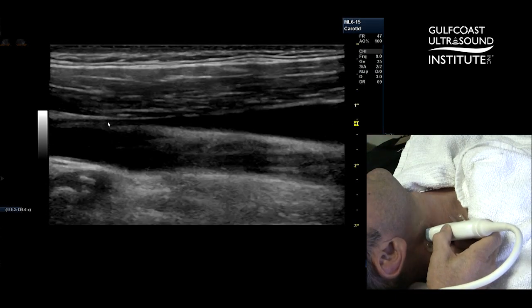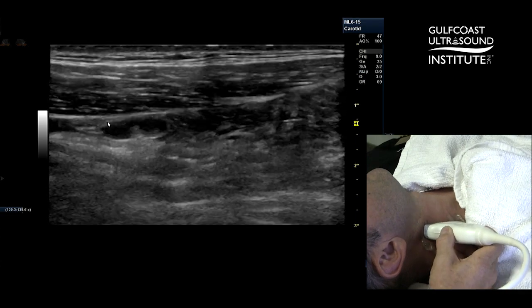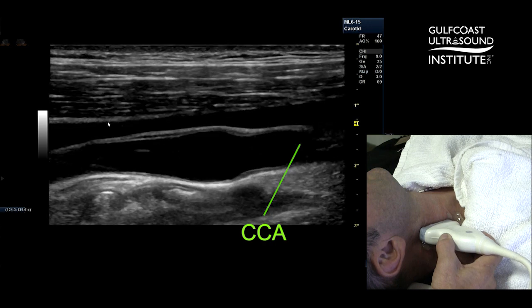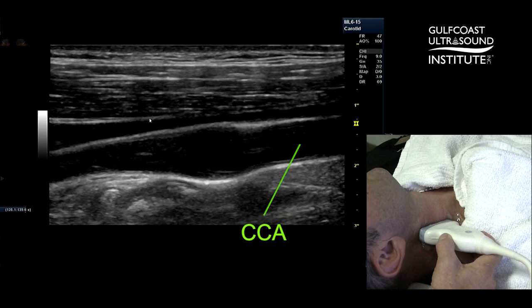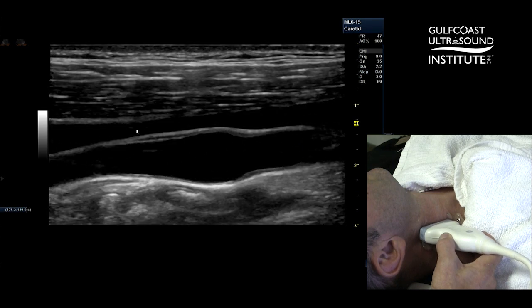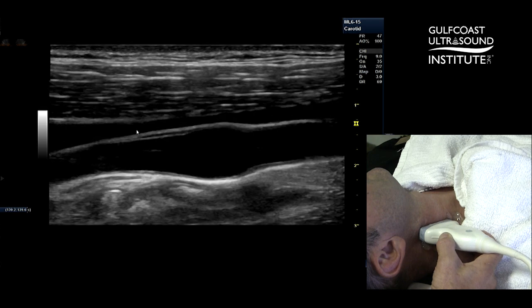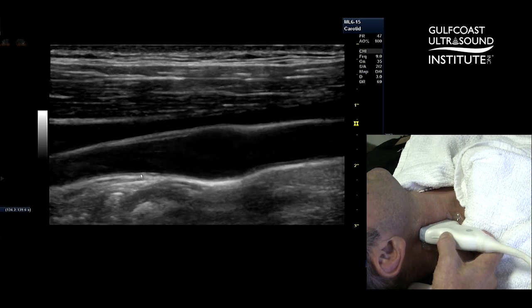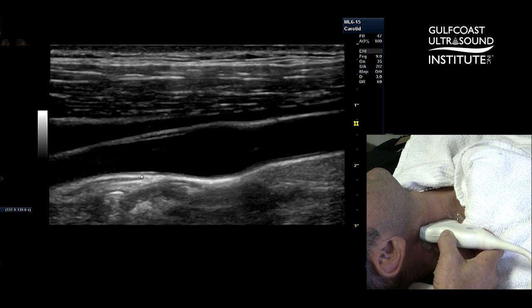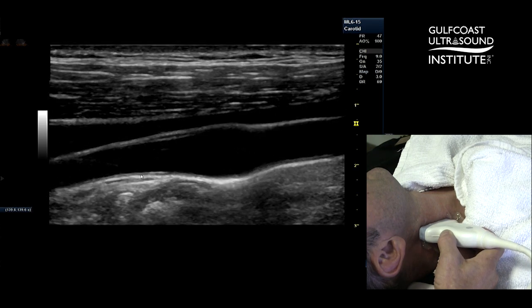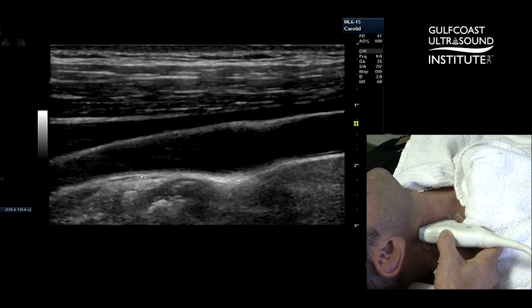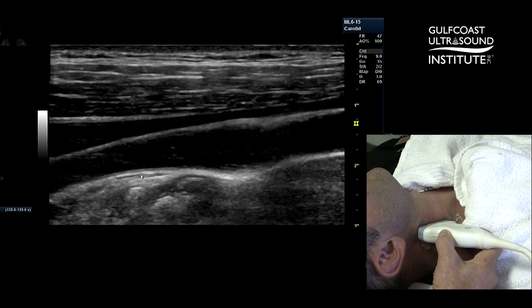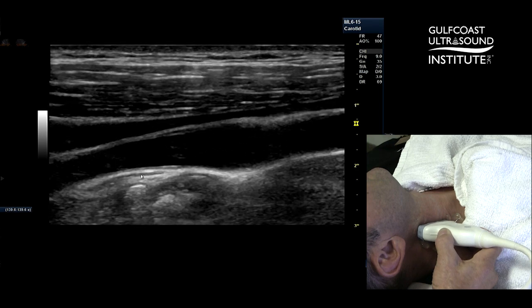As I turn longitudinal and identify the common carotid and sweep up towards the bulb area, I try and come in from a posterior approach — posterior lateral — so I can come through the jugular vein. This gives us an enhanced acoustic window to view the far field wall of the internal carotid artery. In order to differentiate from the external, I'll rotate or just tip the distal end of the transducer — the one towards the ear — towards the mandible, and I expect to see the external carotid.